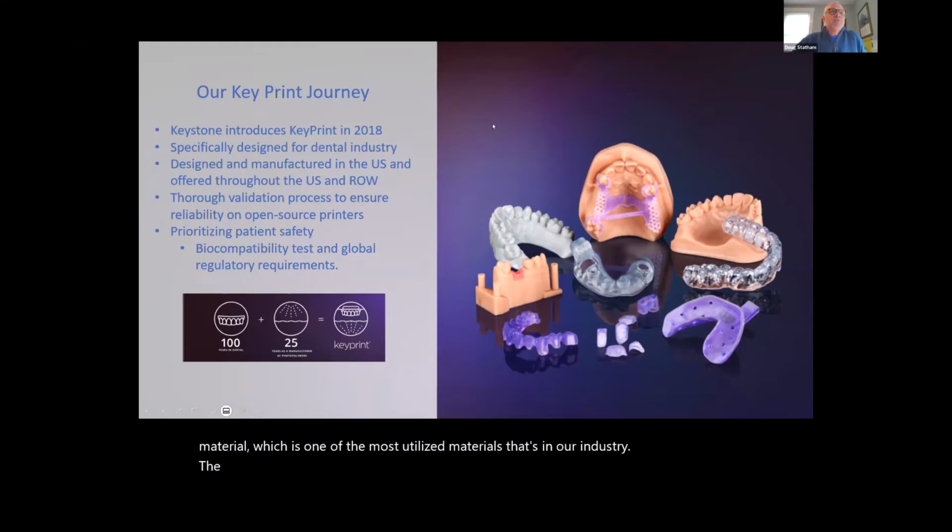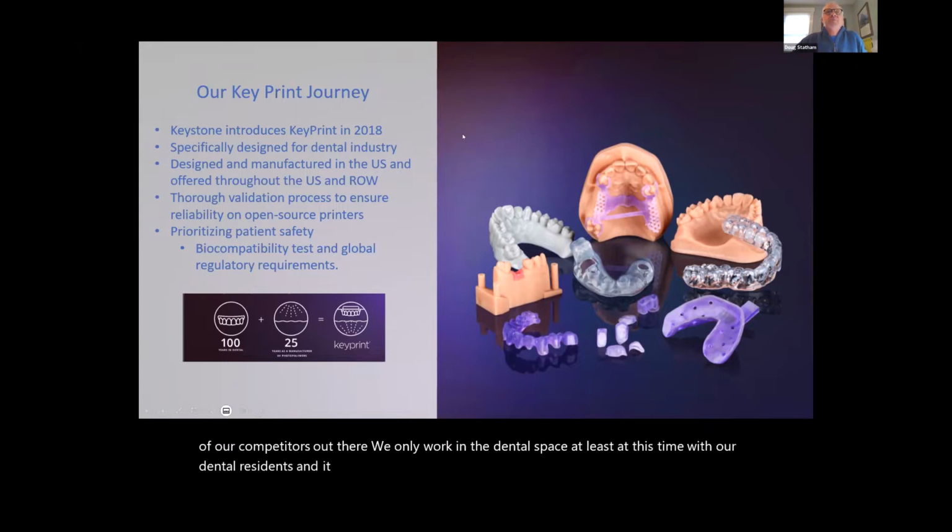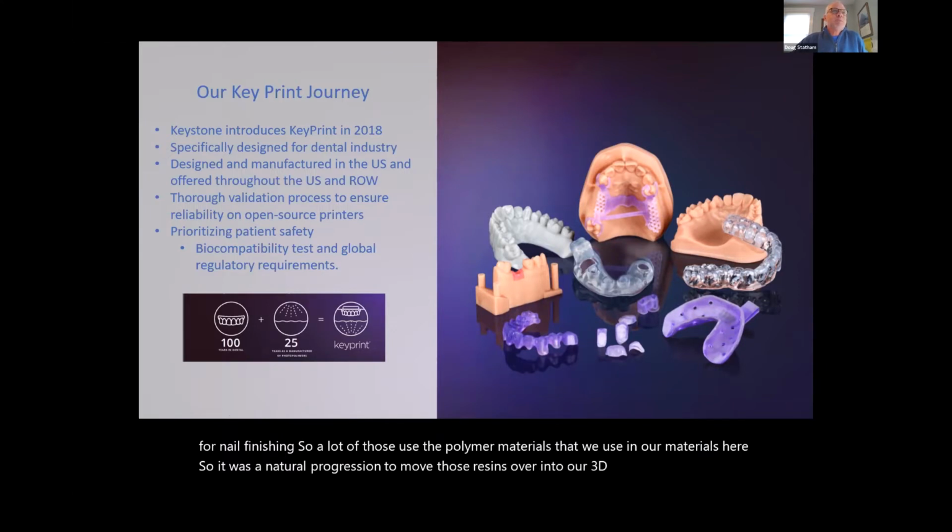All of our resins are specifically designed for the dental industry, so different from a lot of our competitors out there. We only work in the dental space, at least at this time, with our dental resins, and it really started off from our core competency, cosmetic products for nail finishing. A lot of those use the polymer materials that we use in our materials here, so it was a natural progression to move those resins over into our 3D printing solutions.